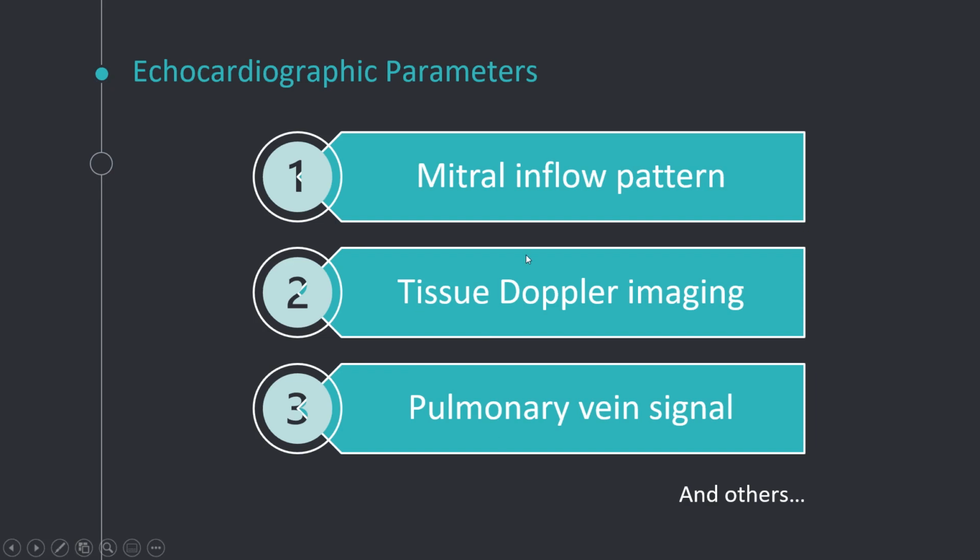And the reason why we need to know about normal diastole is so that we can understand what's happening with all of these echocardiographic parameters. A lot of what I was just talking about focused on the pressure gradient difference between the LA and LV, and what is in between is the mitral valve. So this is one of the first things that people looked at: how can we characterize the blood flow from the LA into the LV? So they looked at the diastolic mitral inflow pattern.